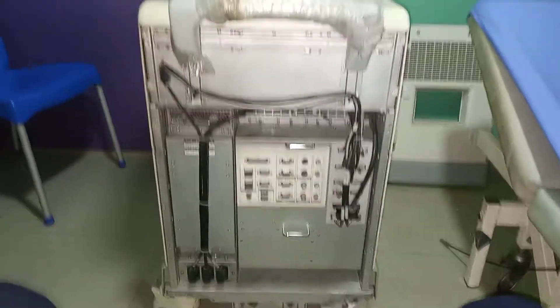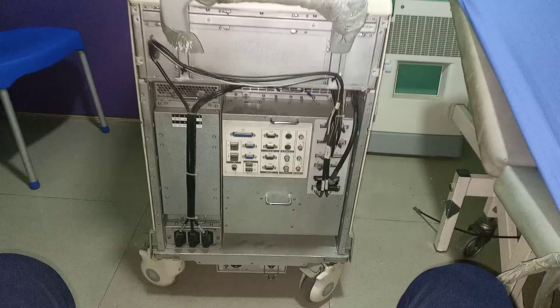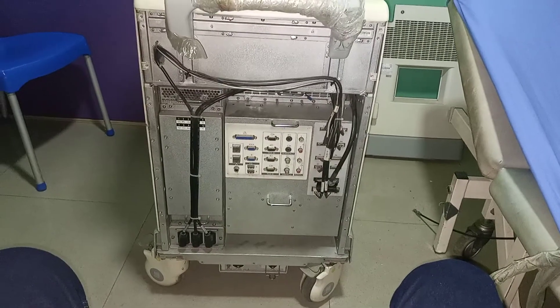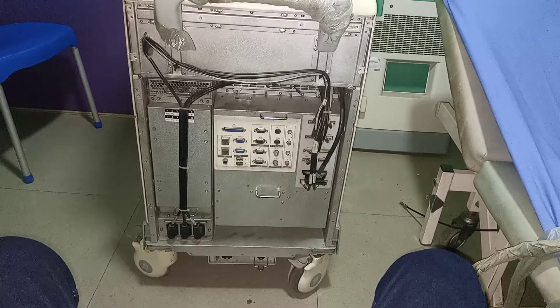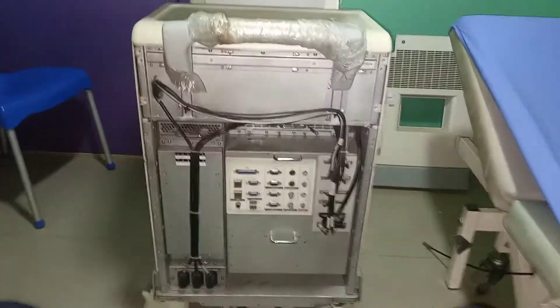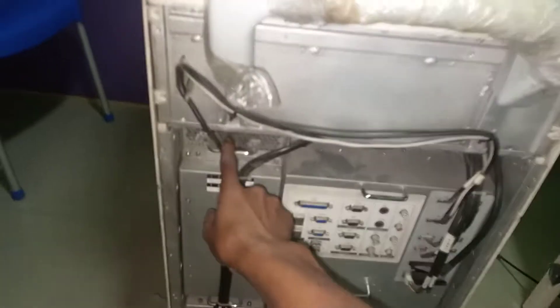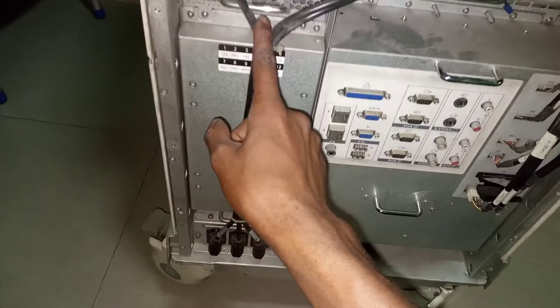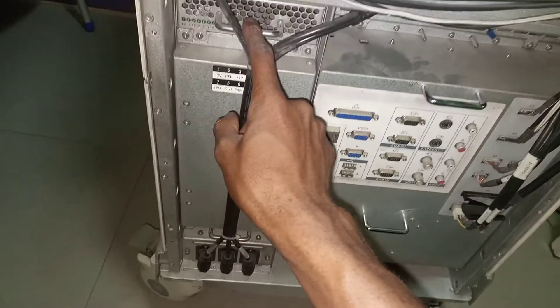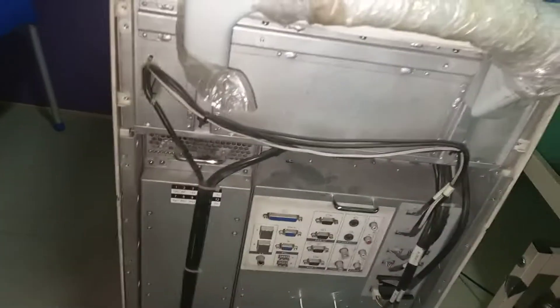This is how the back of the ultrasound machine looks like. This is the power pack — the power supply — where power goes into the machine. This power supply then supplies power to the control panel and every other part of the machine.